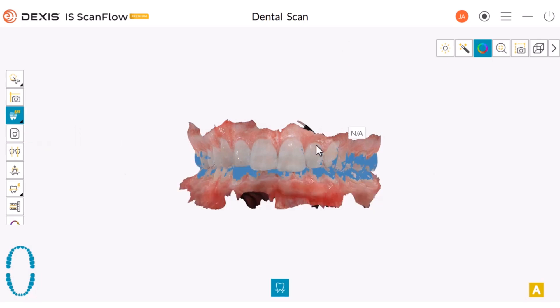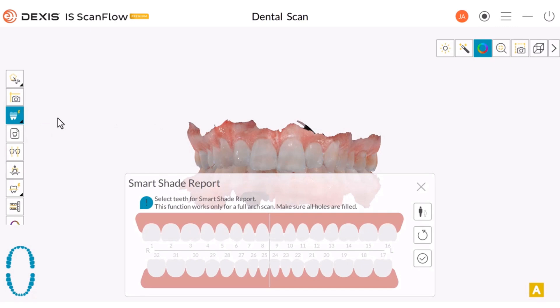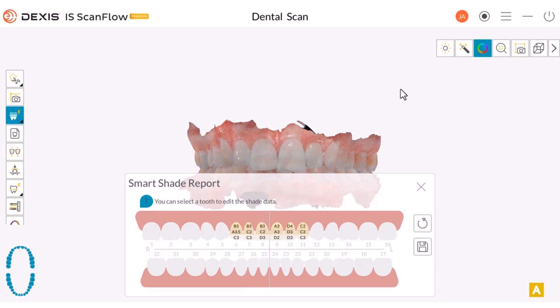If you capture an entire arch, the software displays three gradient shades for each tooth that is selected on the arch. Click on your SmartShade tool. If a different shade matching tool is displayed, right-click on it and then select the SmartShade reports. Select the teeth that you want to include in the report. For this example, we are conducting a cosmetic case for teeth 6 through 11 — we would highlight those teeth. Select the check mark and then the software will generate the SmartShade report.